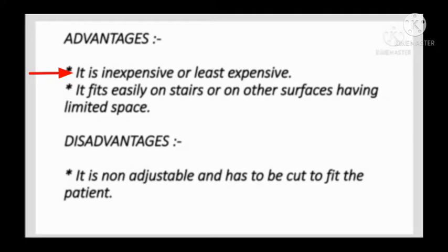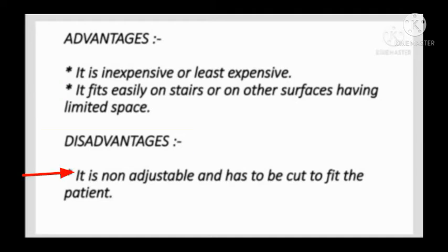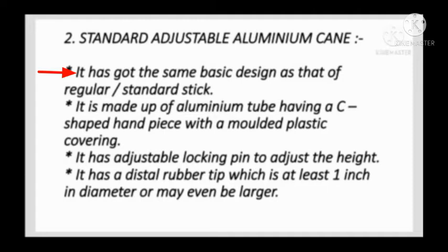Advantages. It is inexpensive, or the least expensive. It can fit easily on stairs or on other surfaces having limited space. Disadvantage. It is non-adjustable and has to be cut to fit the patient. Standard adjustable aluminium cane. It has the same design as that of the regular or standard cane. It is made of aluminium tube having a C-shaped handpiece covered with plastic. It has an adjustable locking pin to adjust the height. It has a distal rubber tip which is at least 1 inch in diameter or maybe even larger.